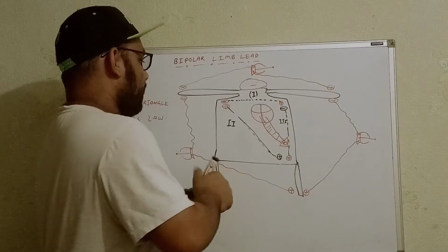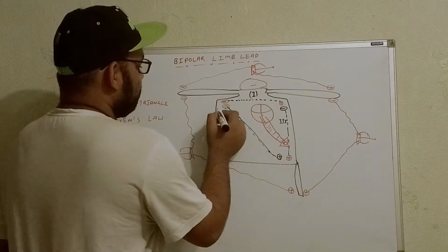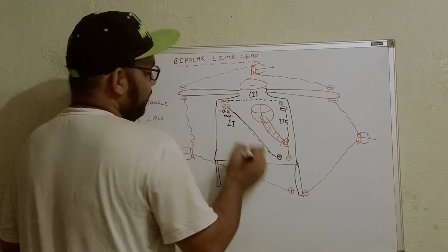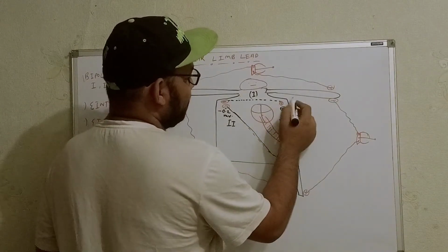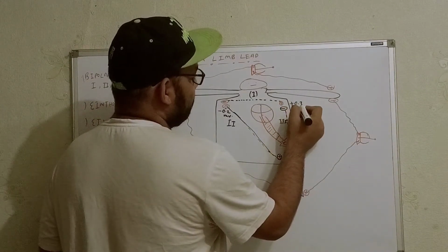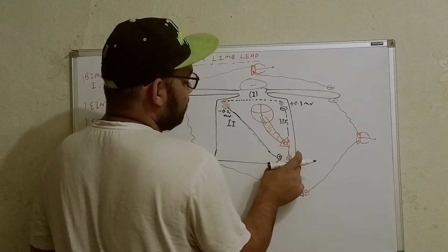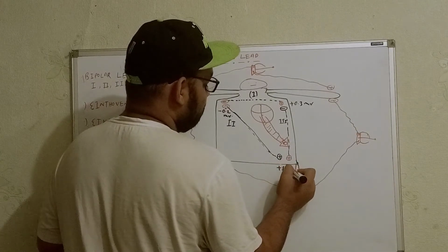Now see, what type of potential you can get. For example, we will get over here minus 0.2 millivolt. Here we will get how much? Minus 0.2 millivolt. Okay, and in the left side we will get a little bit positive, so we will get 0.3 millivolt, and we will get the maximum within this region, so we will get around plus 1 millivolt over here.